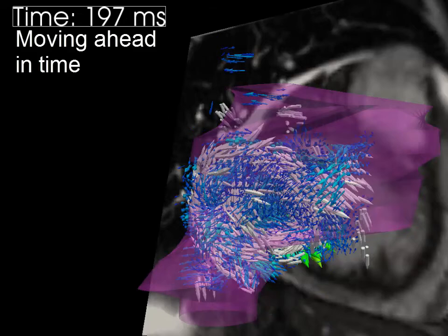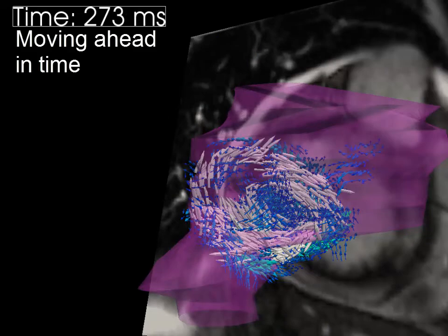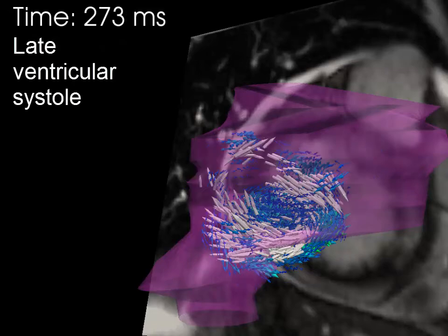Throughout the rest of systole, this regurgitant jet drives recirculating flow in the atrium.